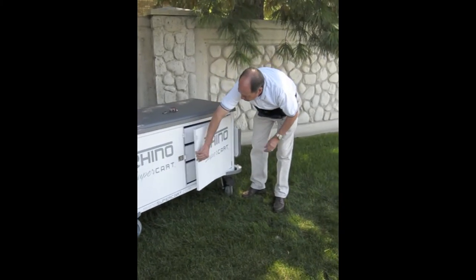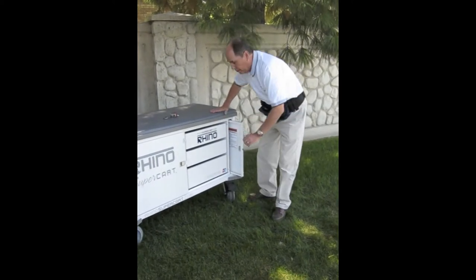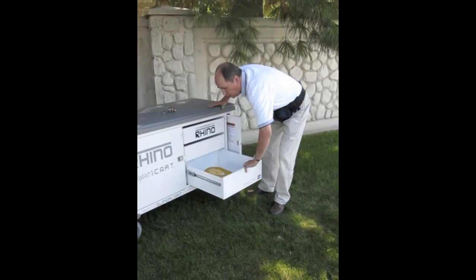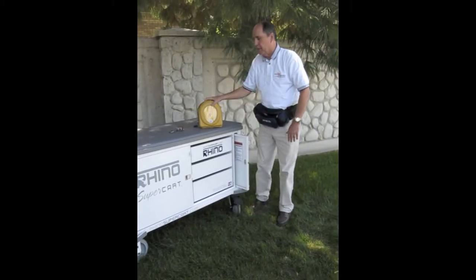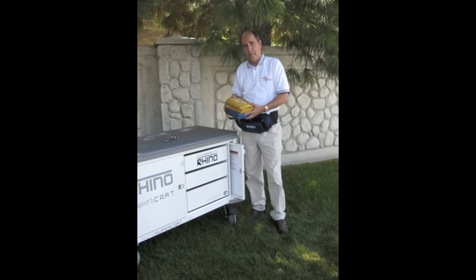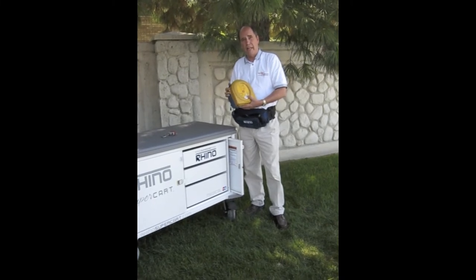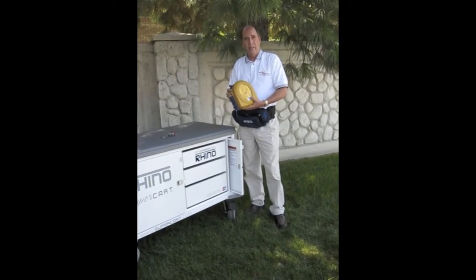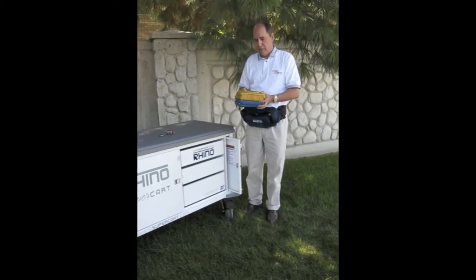On this side of the cart, I've got three drawers that can hold all of my supplies, including an AED in this bottom drawer. The thing I really like about this HeartSign Samaritan AED is how small it is, how powerful, and how durable. It has the highest ratings for dropping and for water infiltration, and is very, very easy to use.